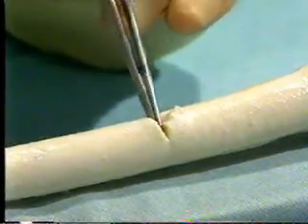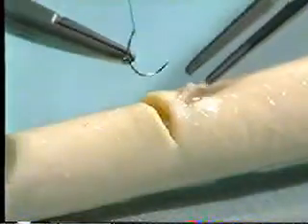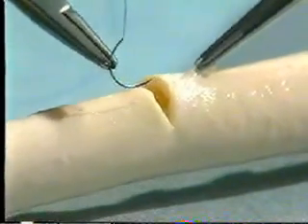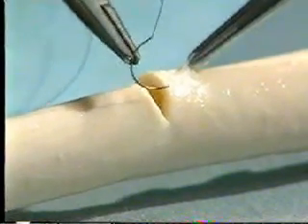Inspect the lumen using a pair of atraumatic forceps as shown. For primary closure of the arteriotomy, use two appropriately sized double-ended arterial sutures.